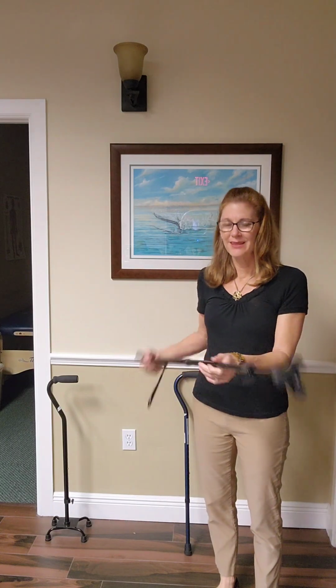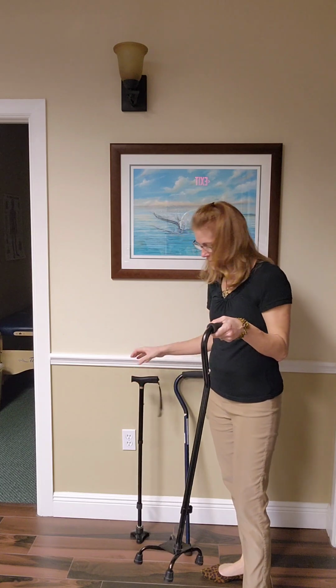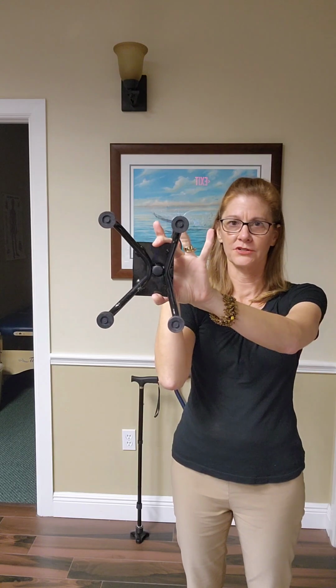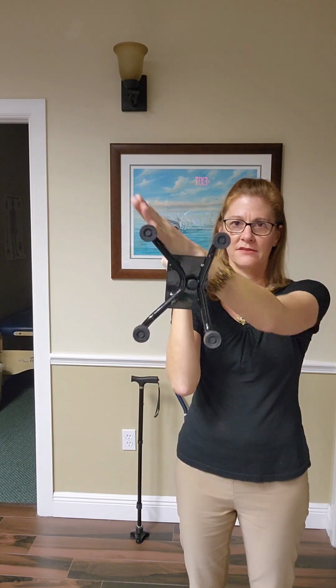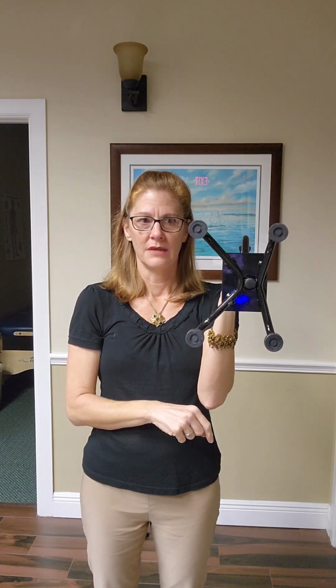The tripod cane, really the same thing. It doesn't matter which hand you hold it in, it's pretty straightforward. The quad cane. I tend to use the quad cane more for someone who does need to put a little pressure on it, like if someone's had a stroke and they have weakness as well as the balance issue. This one happens to be a good height for me. What you need to know about these guys here is that you notice it's not a perfect rectangle, that these legs of the base of the cane are closer to the center here than these that are angled out a little bit. This is meant to be used in your right hand so you don't trip yourself. If I used it on the left side, because these stick out more, I'd be more apt to trip myself.